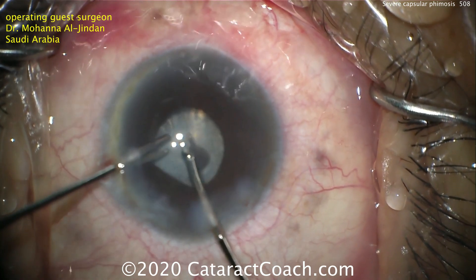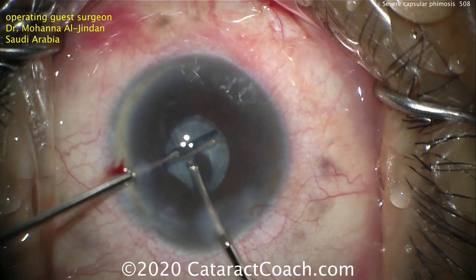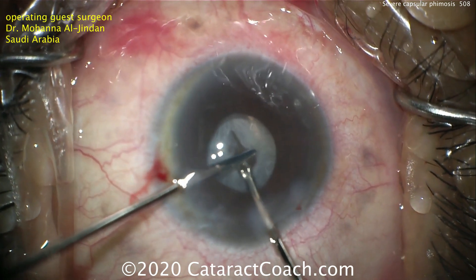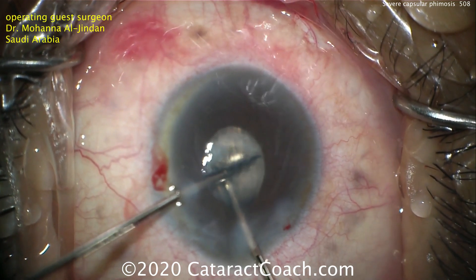Now micrograspers and micro forceps are used to try to grab this and maybe tear a larger capsulorhexis. But this tissue just doesn't want to tear, and that's kind of the nature of this fibrotic tissue.